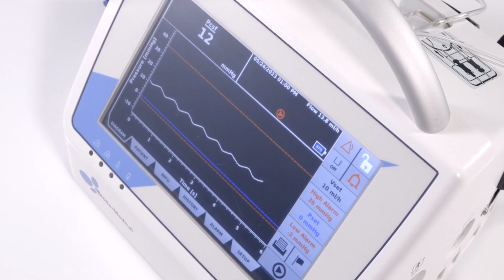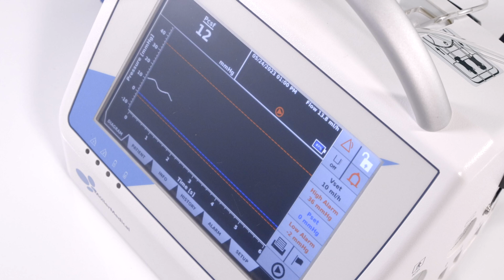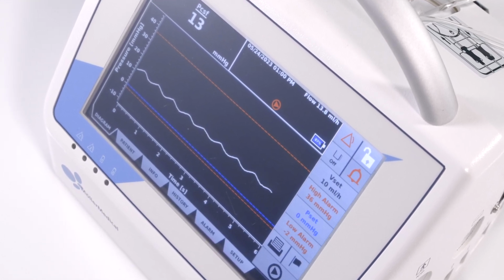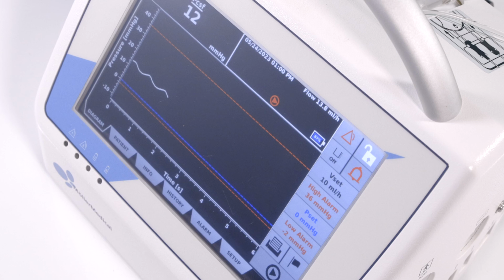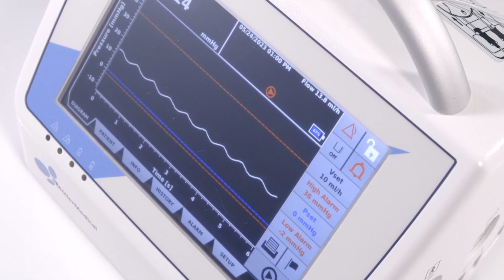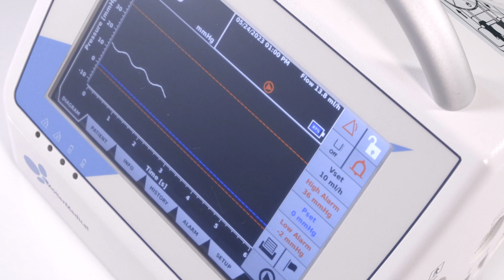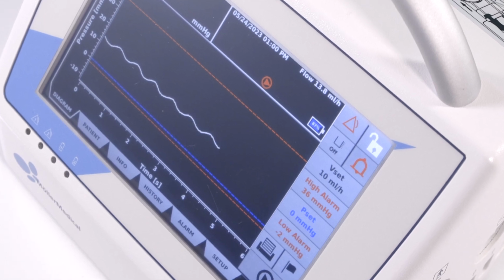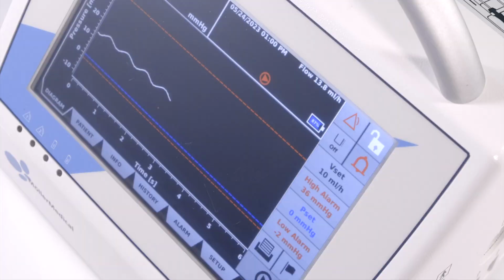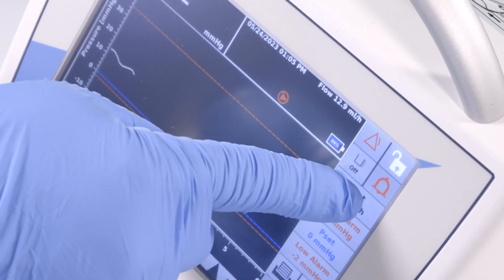Liquoguard 7 may also be programmed to continuously drain a specific volume of CSF each hour independent of the patient's pressure. When the patient's CSF pressure remains above the value of P set, Liquoguard drains CSF continuously at the user-defined hourly flow rate. Set the volume of CSF to be drained each hour.